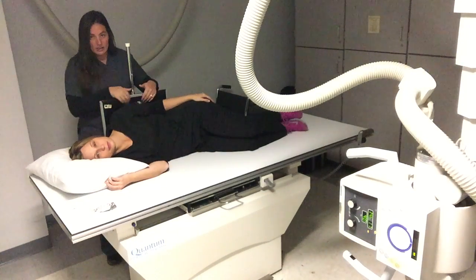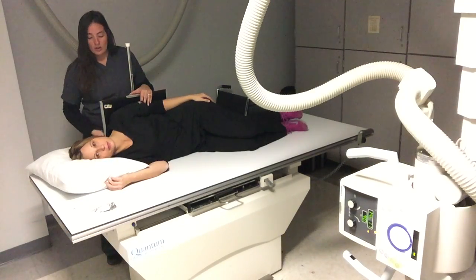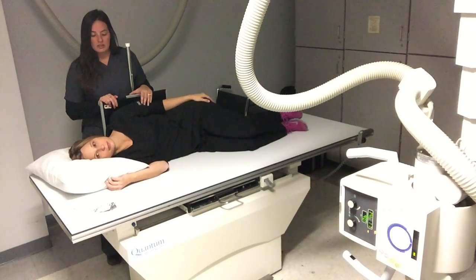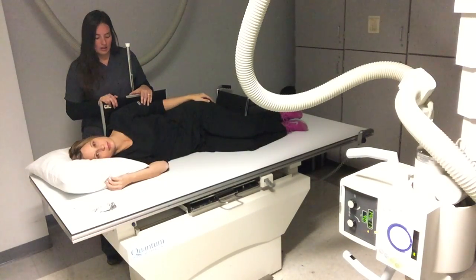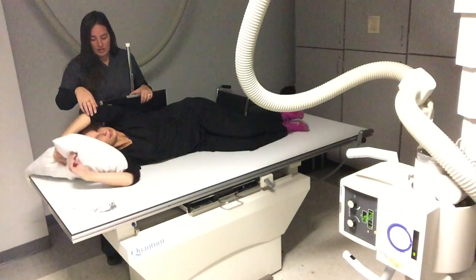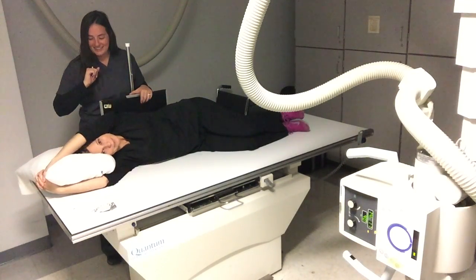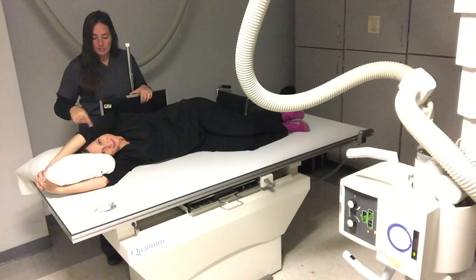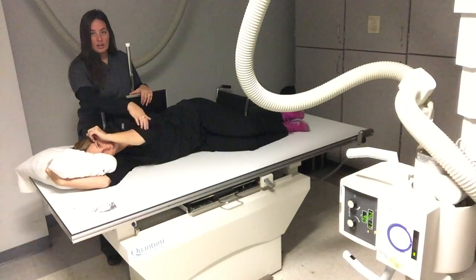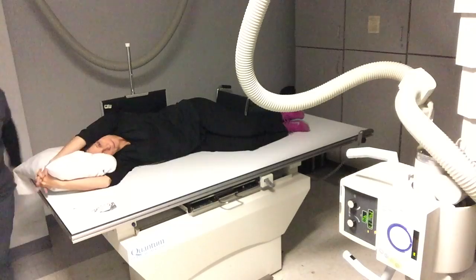In an ideal situation we would have a pad underneath her to give us more cassette coverage at the bottom — we have a lot of cassette up top that we're not using. We're not going to require that for your practical, so we won't demonstrate it here. I'm going to have my patient bring both arms straight up over their head, making sure their elbows are up high and not still in front of their chest — nice and high and out of the way.